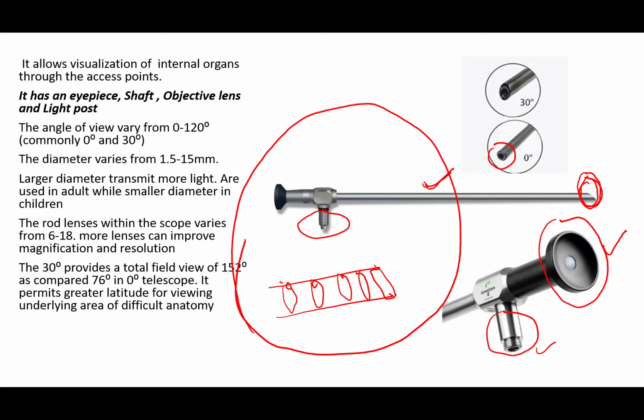So it's just a normal, optimal body temperature that will not cause any burns or injury to the patient. You will not feel any heat from the emitted light because the device is designed to give that.